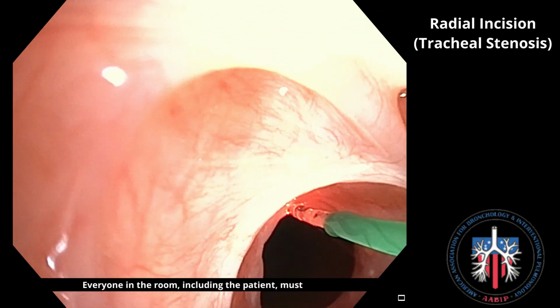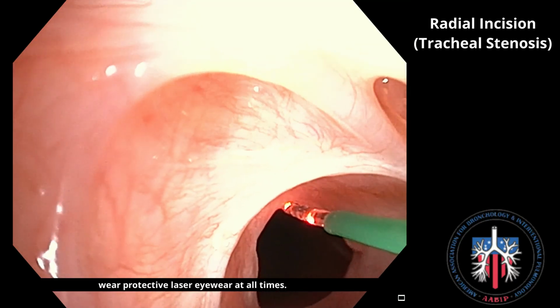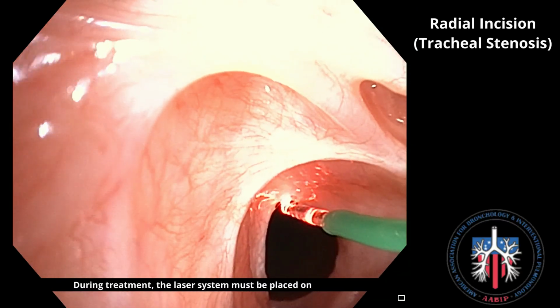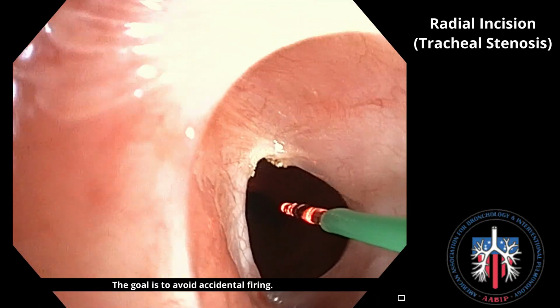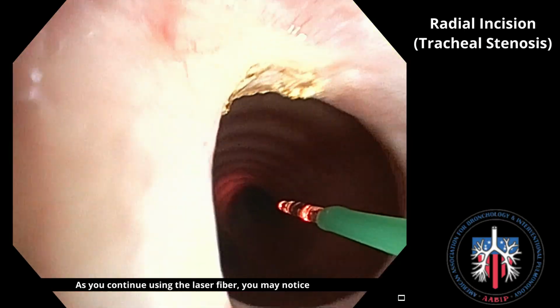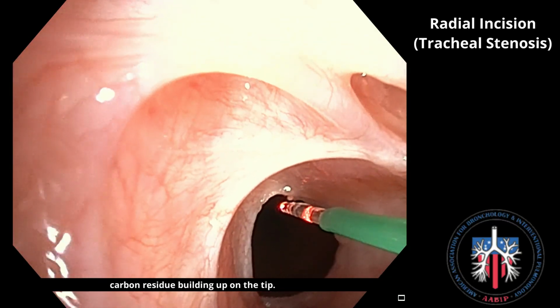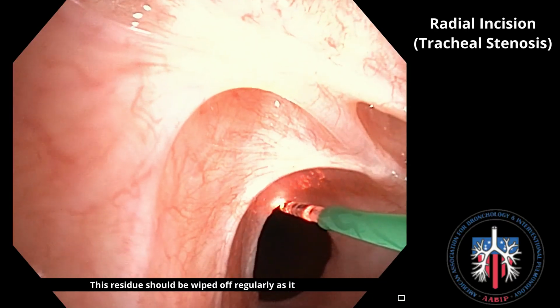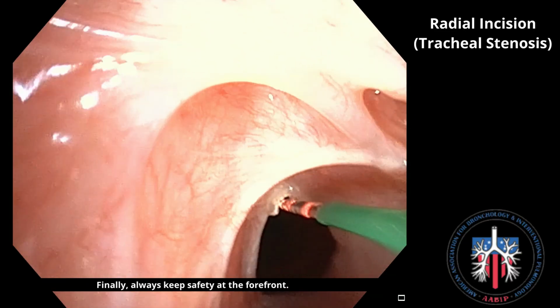Everyone in the room, including the patient, must wear protective laser eyewear at all times. During treatment, the laser system must be placed on standby whenever not actively in use. The goal is to avoid accidental firing. As you continue using the laser fiber, you may notice carbon residue building up on the tip. This residue should be wiped off regularly as it poses a fire risk and can affect laser performance.